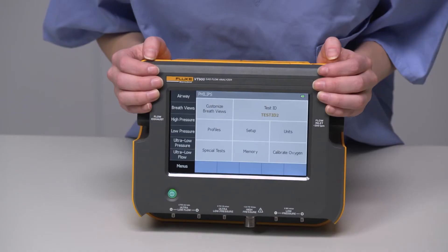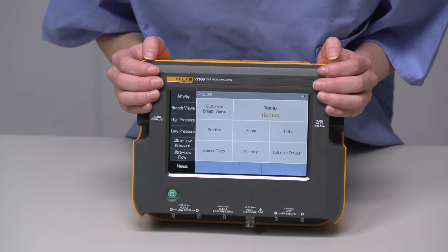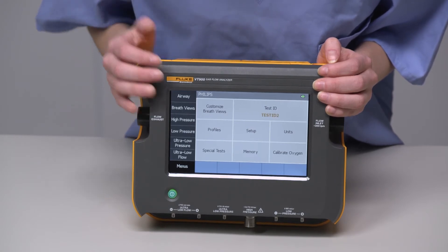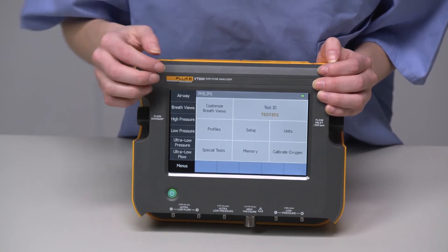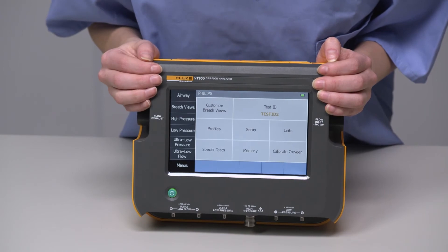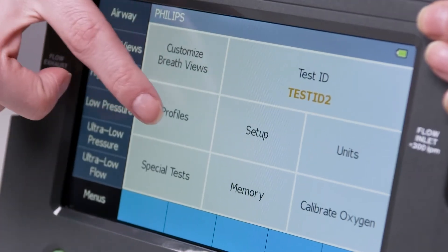When we have the device set up the way we need for our model or type of testing, we can now save it as a profile. From the menu setting, select Profiles.